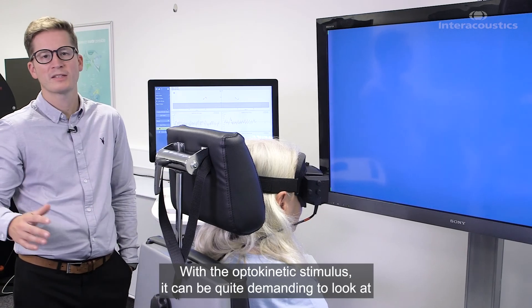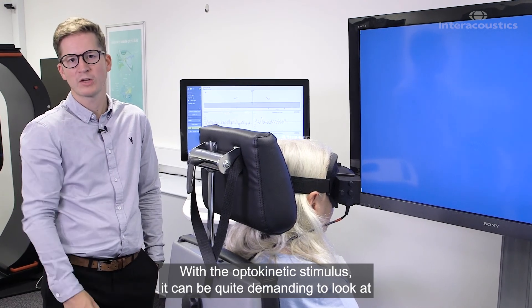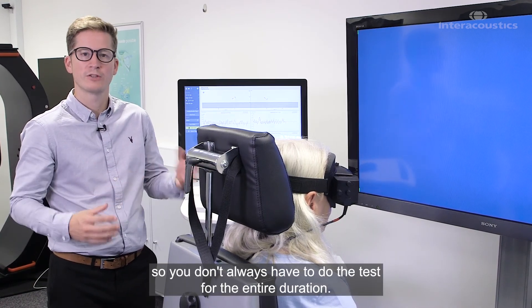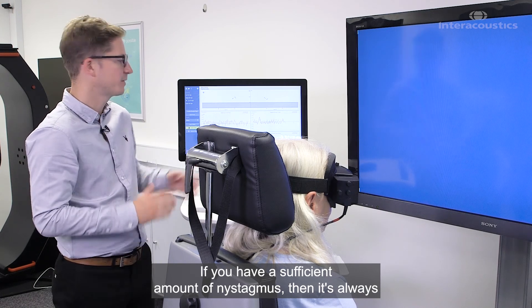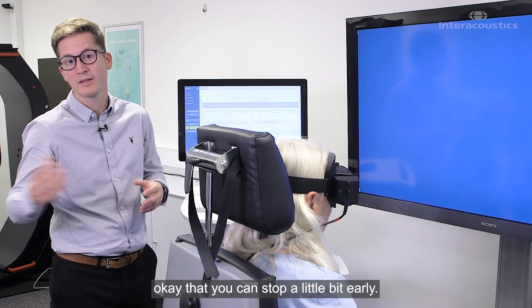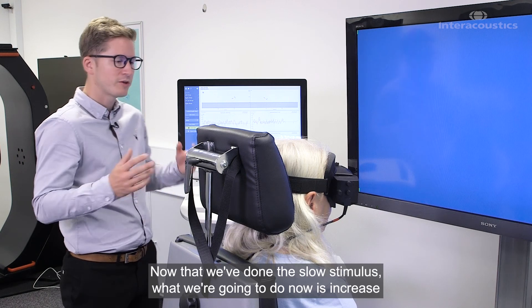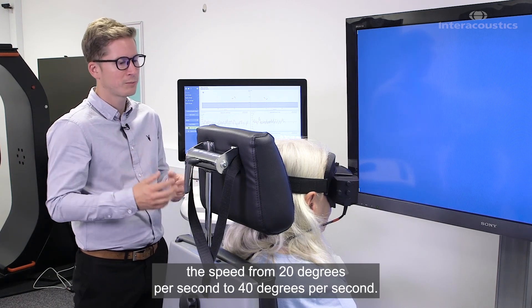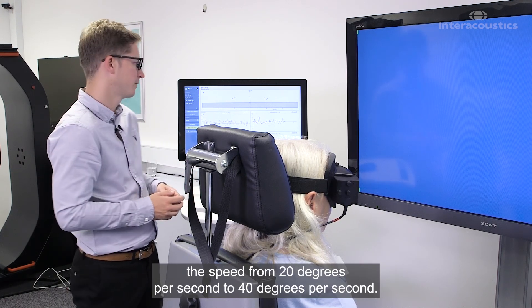The optokinetic stimulus can be quite demanding to look at, so you don't always have to do the test for the entire duration. If you have a sufficient amount of nystagmus, it's okay to stop a little bit early. Now that we've done the slow stimulus, we're going to increase the speed from 20 degrees per second to 40 degrees per second.